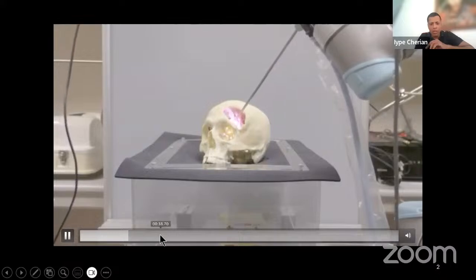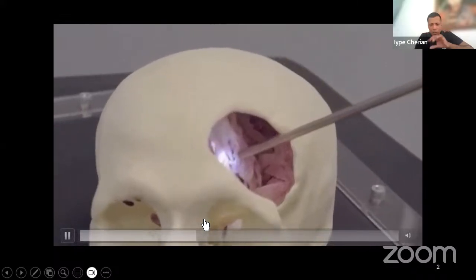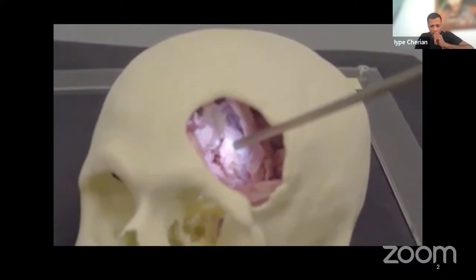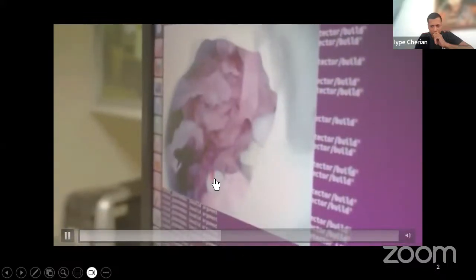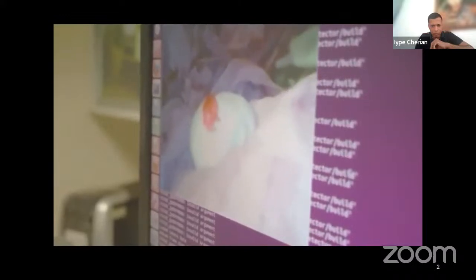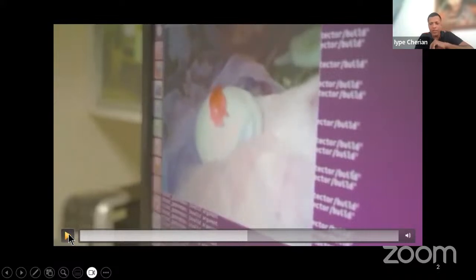And what it is doing is it can do a pattern recognition and centralize the image. That's what it's doing. It will look for the mark, it will scan the image, and when it sees that pattern, it will centralize it. You can see the mark there. It will centralize it now. So I don't think any exoscopes even right now can do it. So this was our work with a shoestring budget, with literally no budget at all.